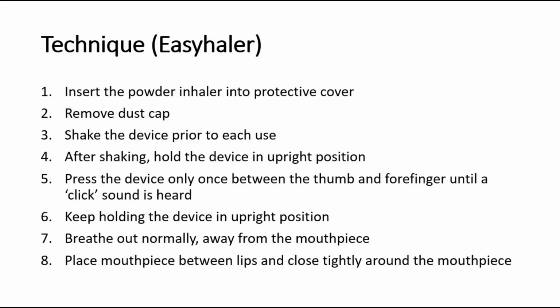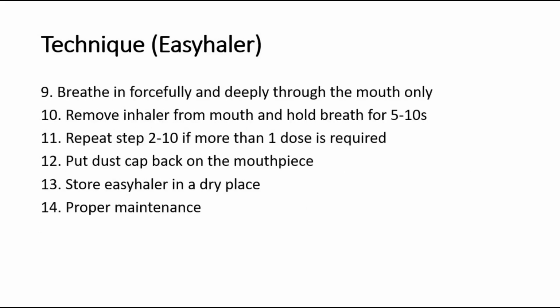Press the device only once between the thumb and the forefinger until we hear a click sound. Keep holding it in an upright position. Breathe out normally, away from the mouthpiece first, and then when the patient is ready, we place the mouthpiece between their lips and close the lips tightly around the mouthpiece. So ask them to breathe in deeply through the mouth only.